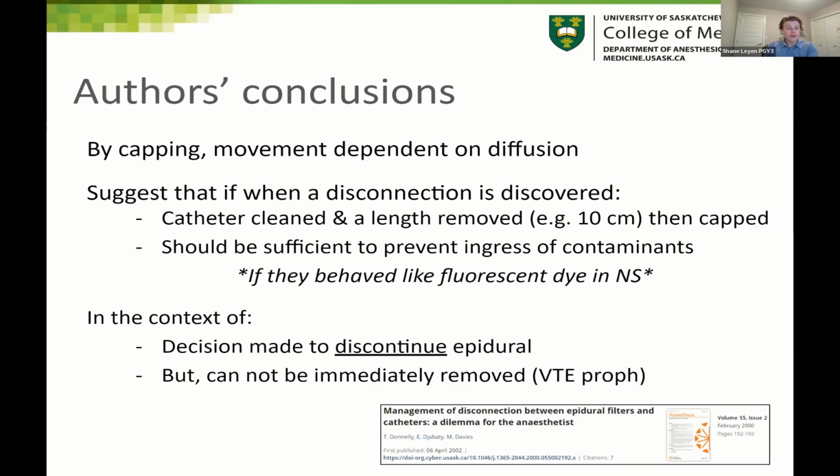This is all in the context of the decision has been made to discontinue the epidural, but it cannot be immediately removed due to VTE prophylaxis, or recent VTE prophylaxis administration.